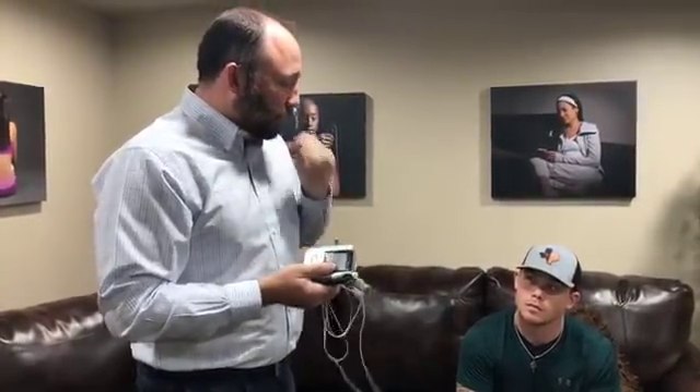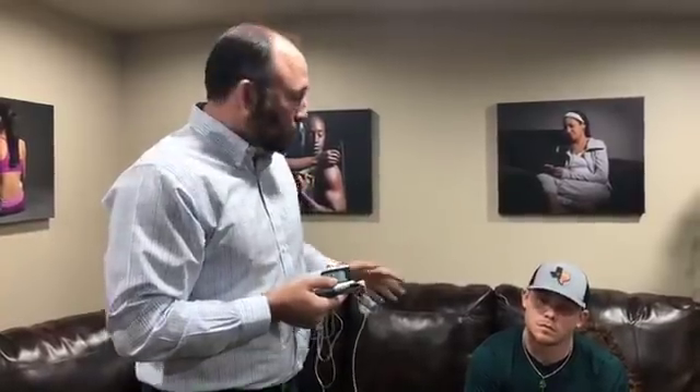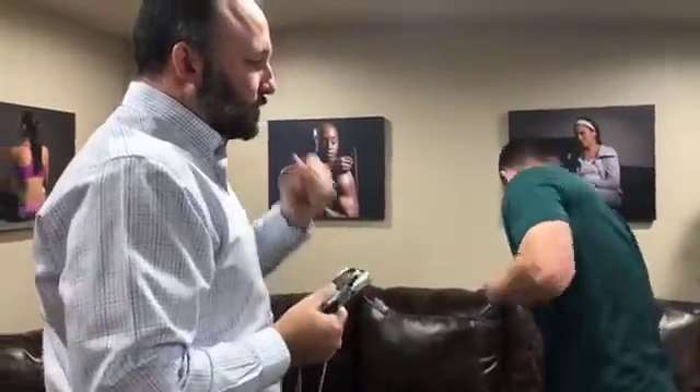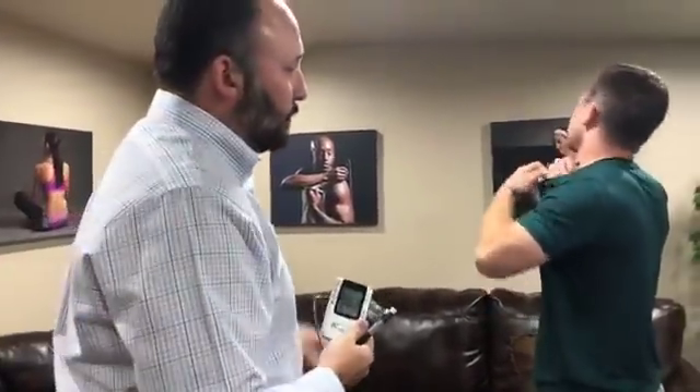With the probes, our window of relief is around 12 hours on the short end and around 48 hours on the long end. What we know is it's cumulative — so even if Travis got 12 hours of relief the first time, with the next treatment he'd get more like 18, 24, 48, and so on. You get to a point where you only need it every couple days. So Travis is going to stand up and we're going to treat his back now. Treating back pain is one of the more common questions we get.